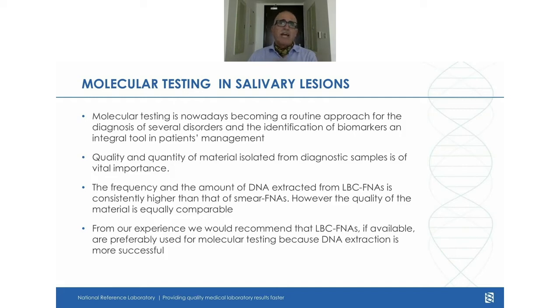So we checked for BRAF mutation both on FNA and old slides which have been scraped. And when there was a mutation, it was identified with both methods. So this is going to be pretty much the future. Actually, it's the present. And I'd just like to inform you that at NRL we'll have a next generation sequencing platform ready and available in the next few months.